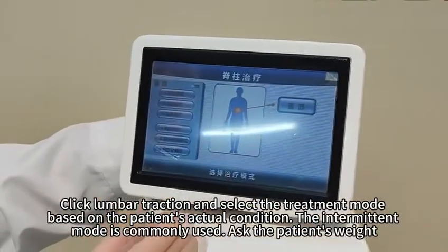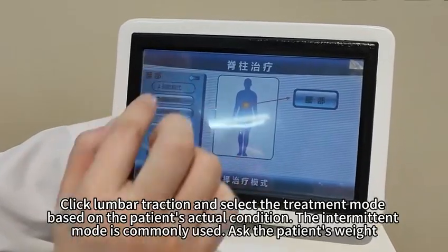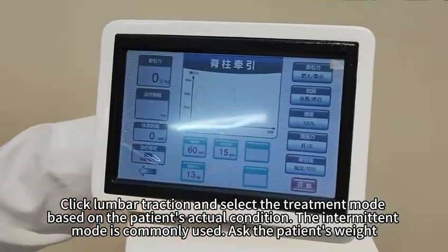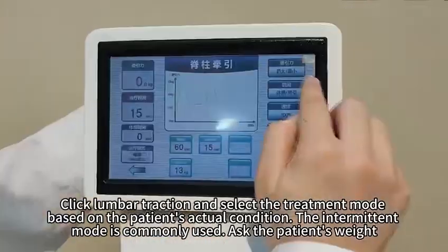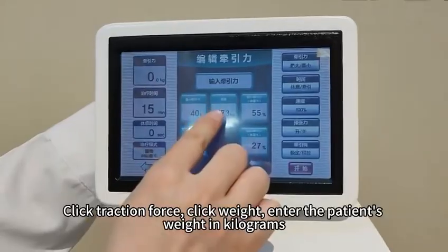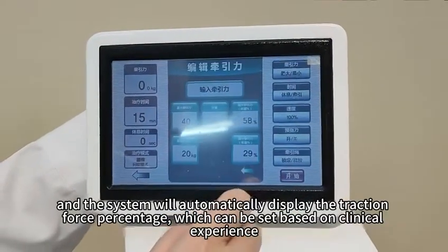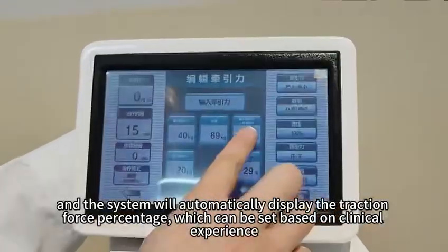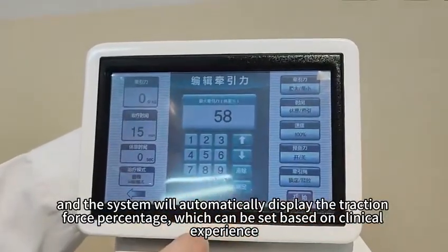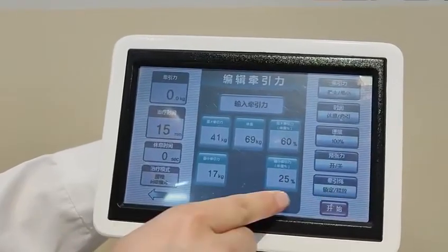Click lumbar traction and select the treatment mode based on the patient's actual condition. The intermittent mode is commonly used. Ask the patient's weight. Click traction force. Click weight. Enter the patient's weight in kilograms, and the system will automatically display the traction force percentage, which can be set based on clinical experience.